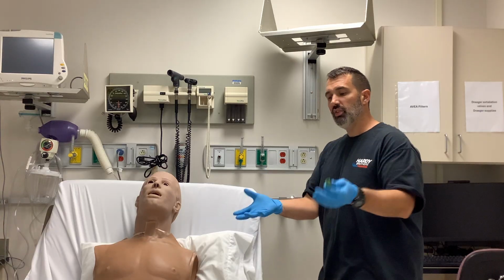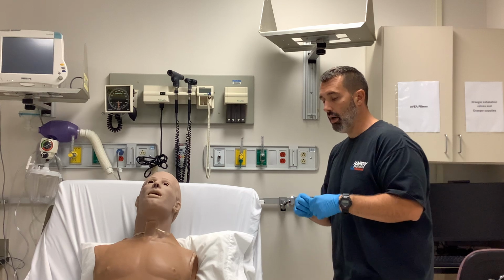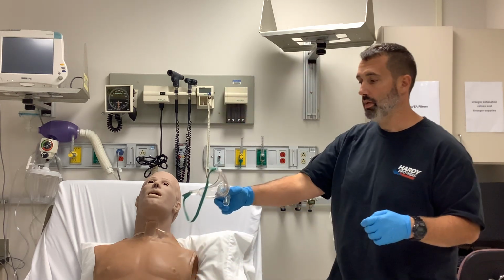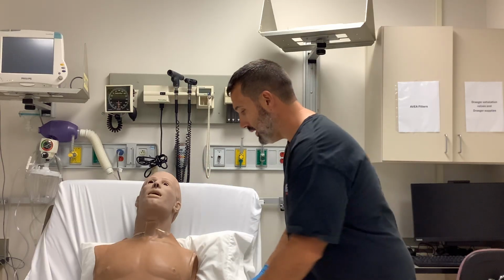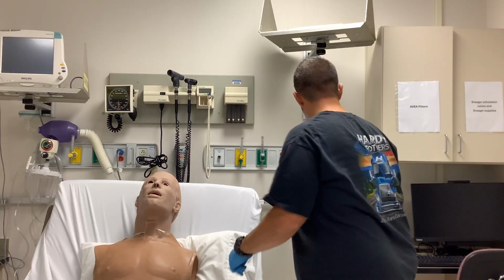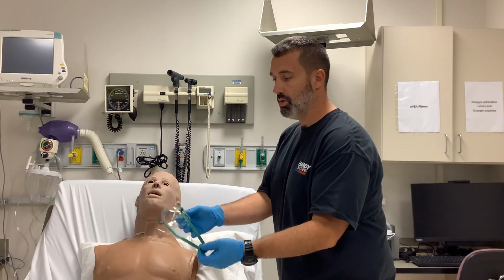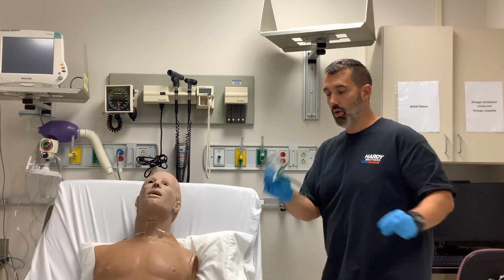But we're going to talk about taking in that oxygen for the patients that we're going to be taking care of. You may be tasked with setting up a tracheostomy collar for a patient if they happen to have a tracheostomy tube. You may be tasked with setting up just a regular aerosol mask. Here it is. This happens to be a pediatric aerosol mask, but nonetheless, it's just a smaller version of what the adult one looks like. So this is a regular aerosol mask.